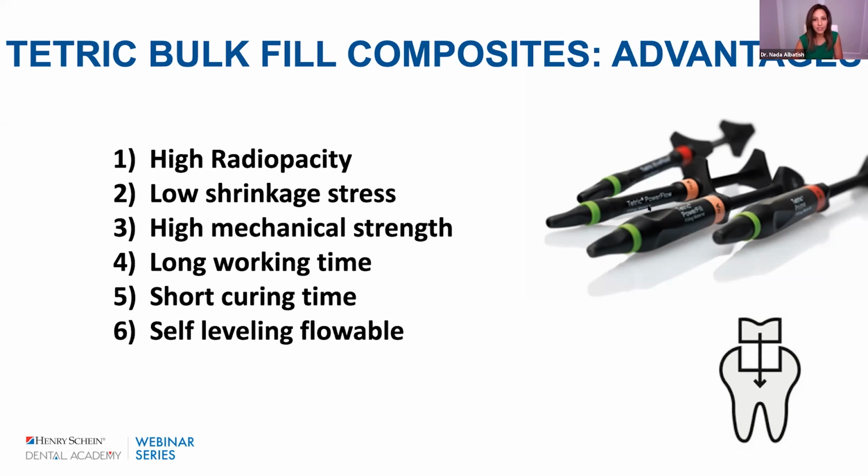The flowable here is self-leveling, and I mentioned this to you already, and it's just an incredible thing to be able to keep the tip in the flowable, place it across the floor, and then just sit back for a few seconds, watch it level itself, and then 3-second cure.